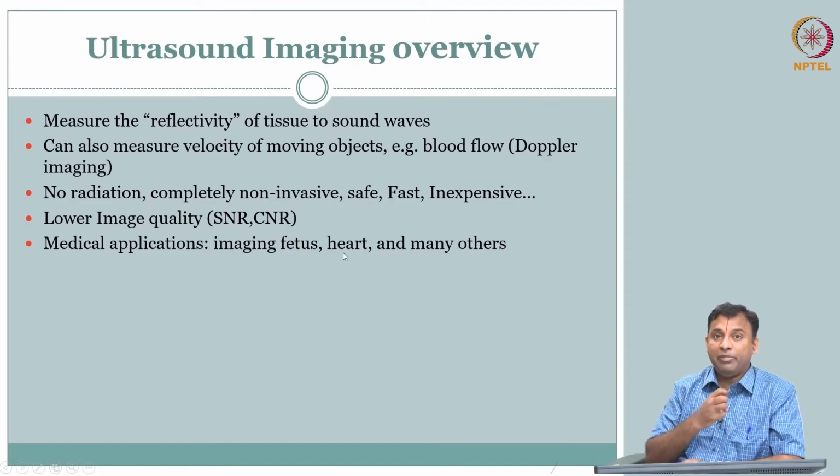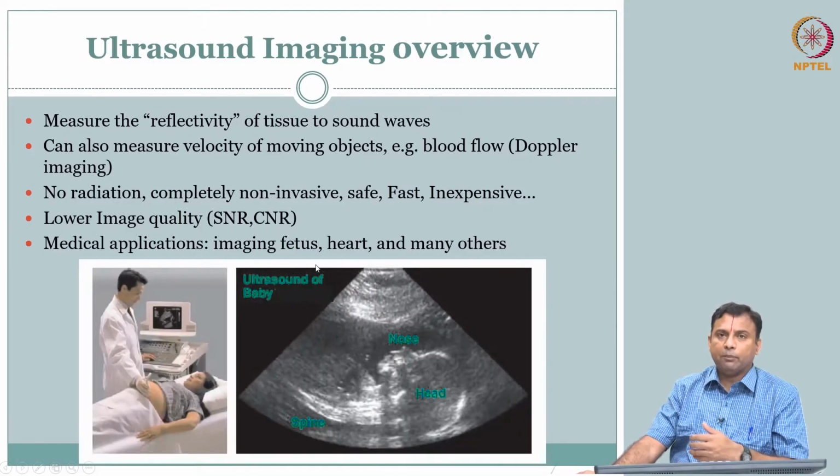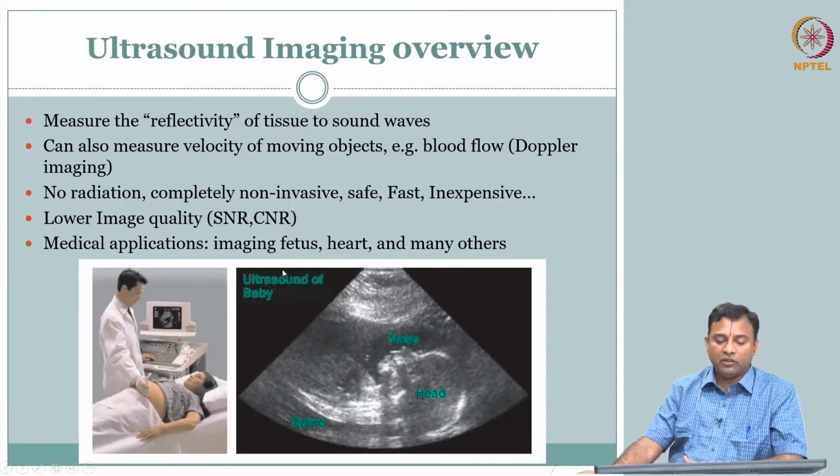Heart imaging, you can see a live beating heart, right. That is another powerful application. Echocardiography is something you would have heard of. There are several applications like that, but the point is just to bring out some of the things you may be familiar with. So, this is non-invasive: you are looking at the baby inside the tummy by placing a probe on the outside. You can also see that this is regional, he has it in his hand and is moving it around. This is a typical scanner, and it is beside the patient, so the patient can also see, right.